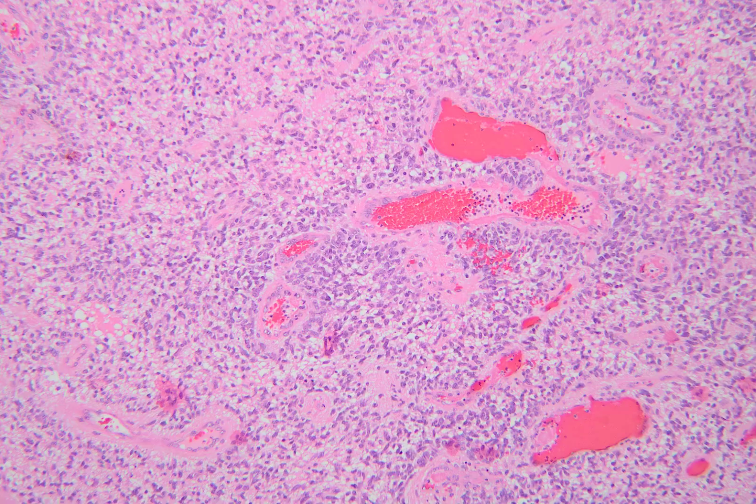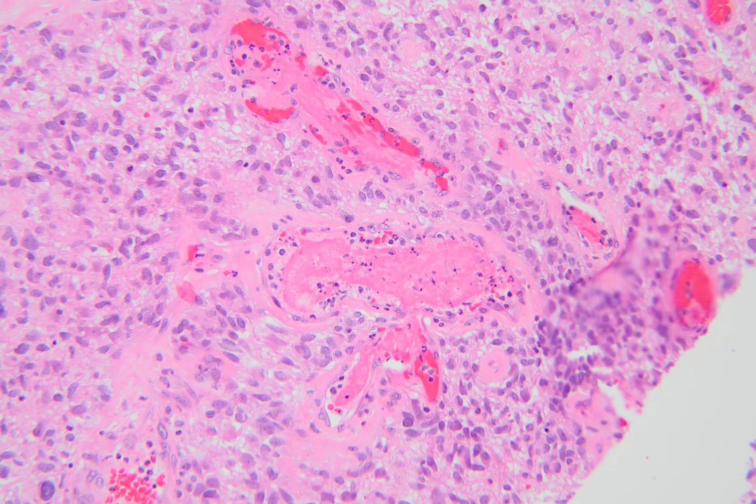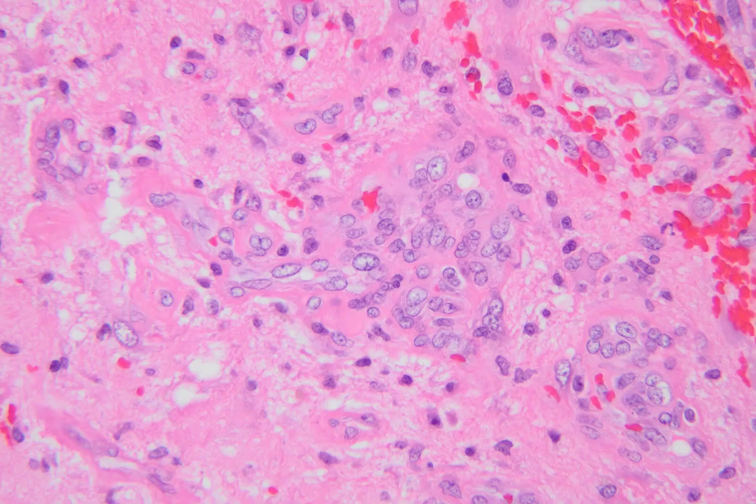The tumor cells show a tendency to collect around blood vessels. This is accompanied by vascular alterations, including thrombosed blood vessels. This image shows the characteristic vascular endothelial proliferation. Even if necrosis is absent, this finding is sufficient for a diagnosis of glioblastoma. Note the characteristic features, including tufting and multi-layering of the endothelial cells.